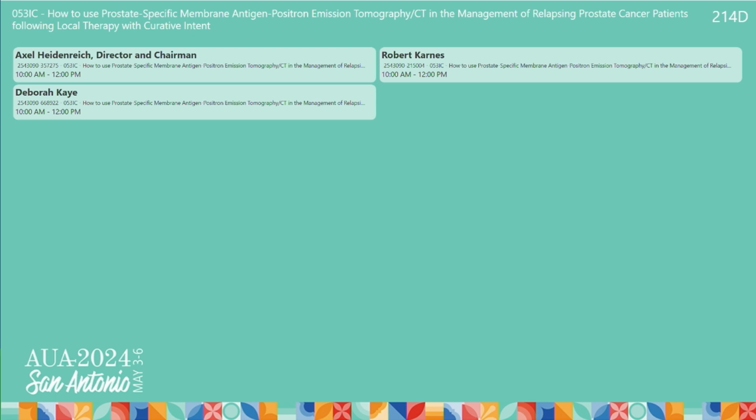We have a couple of patients who demonstrated some intraductal prostate cancer elements in the radical prostatectomy specimen, or who had some cribriform elements or small neuroendocrine elements, which were then responsible for the PSA rise, but which are not detectable by a PSMA PET scan because all these elements are PSMA negative. In this situation, I get an FDG PET CT scan, which is usually positive.